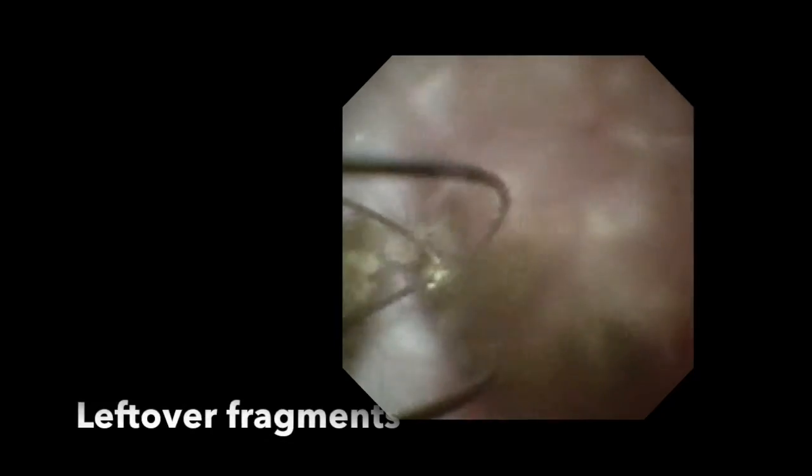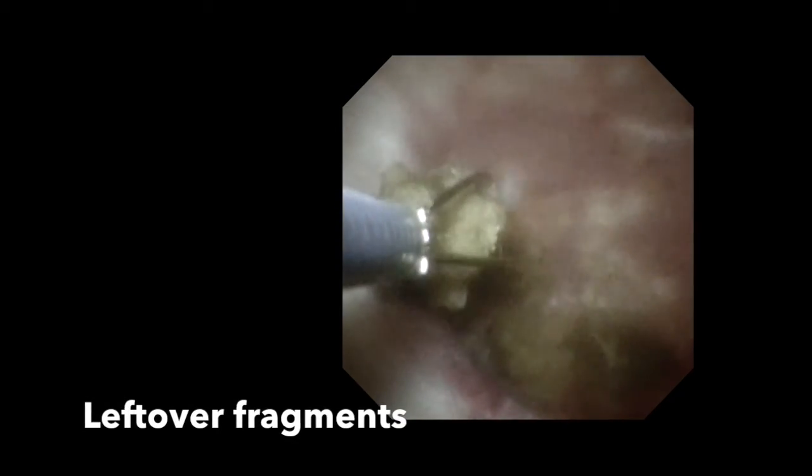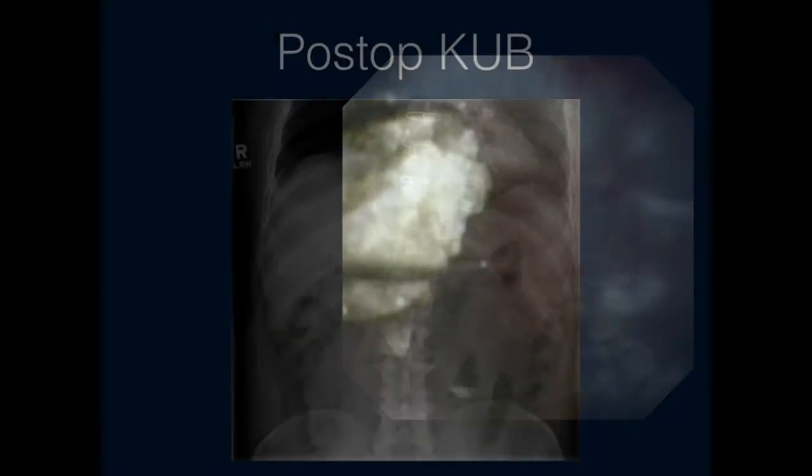The ball-shaped tip allows the fibre to track through a fully deflected scope without damaging the scope. However, it's not uncommon for the ball tip to degrade with increased energy usage. One word of caution is that high pulse energy settings are more damaging to the fibre tip. In general, we find 0.2 joules to be the most optimal pulse energy setting that prolongs the life of the fibre when dusting. In this case, at the end, we retrieved any fragments that were not optimally broken down.